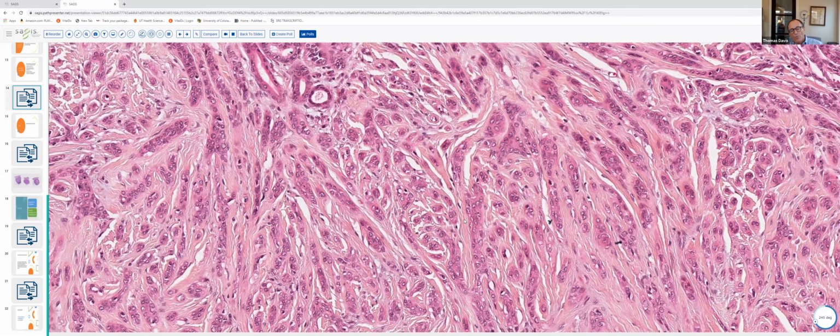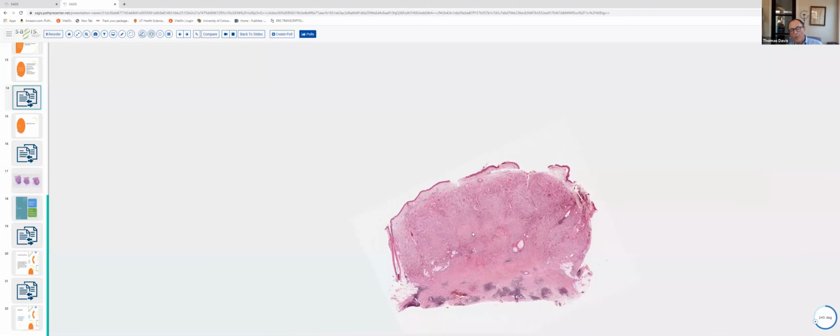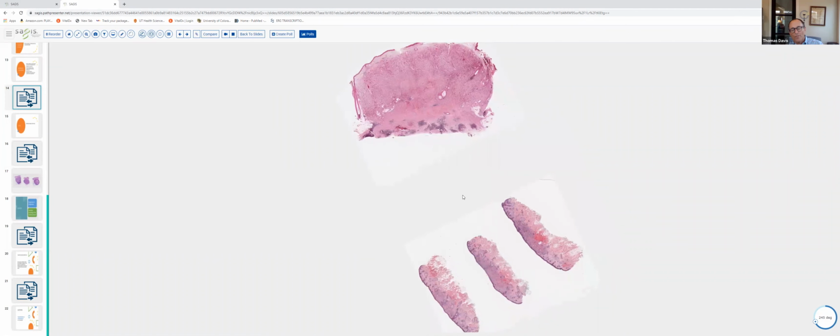Okay, so these are just two examples of an epithelial neoplasm. And again, I wanted to use them to introduce you to the pattern of skin diseases and the key things to assess when you're first starting to look at cutaneous neoplasms. We could give a whole talk on features that would allow you to determine what type of differentiation a neoplasm is showing, and perhaps we'll do that in the future.